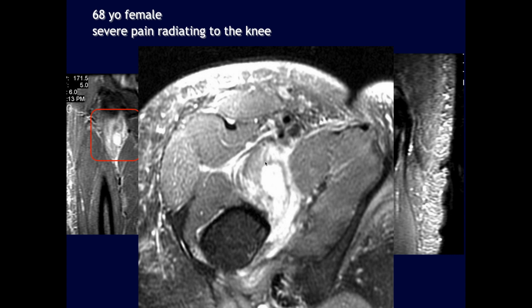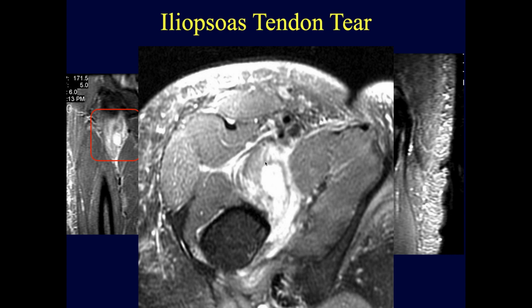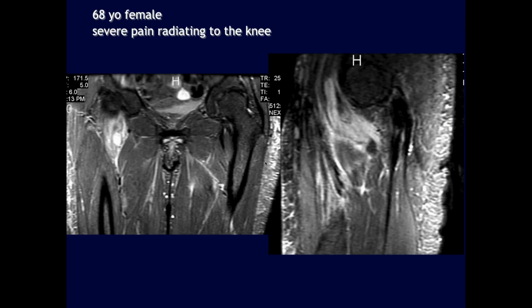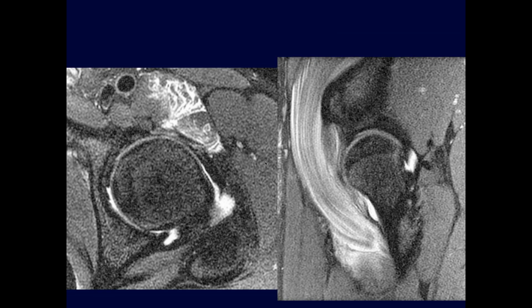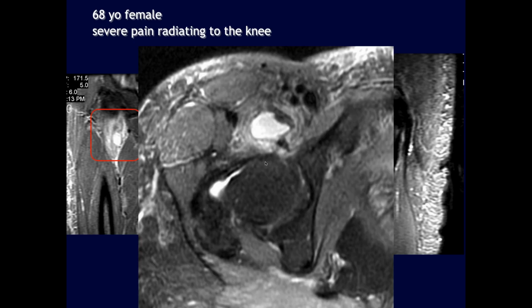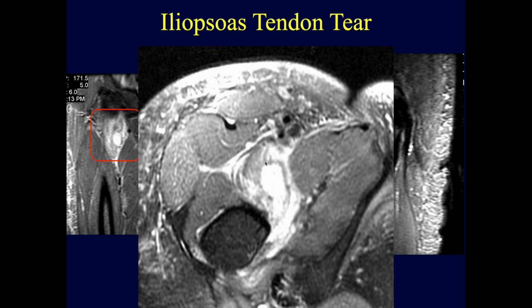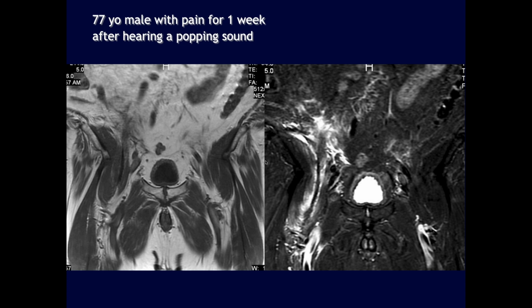This was a grade 3. You said that there are intact fibers? No, actually looking down further, it looked like they were completely absent on that image. We don't see any fibers, so it's a grade 3. I don't see any. It is totally white there. So I think that's a complete tear without retraction. So there's a surgical consideration here, obviously.